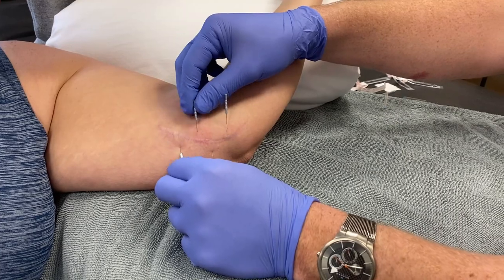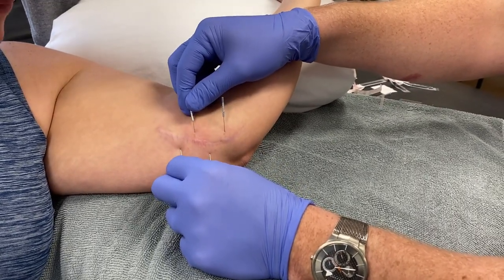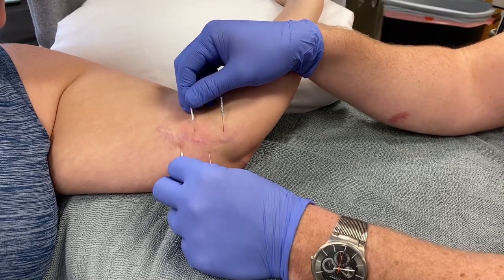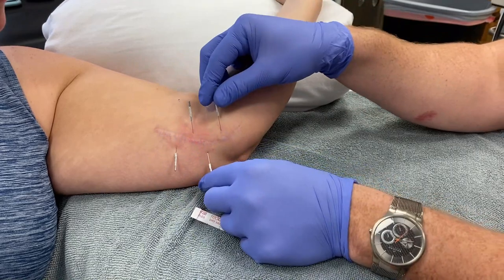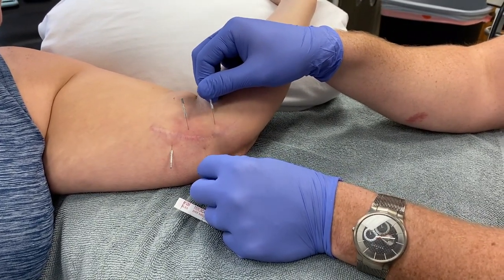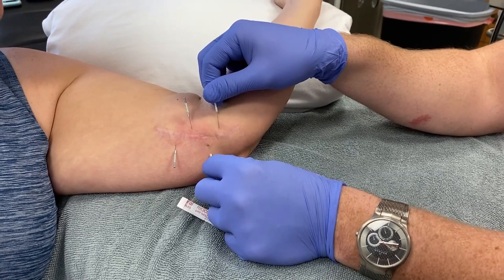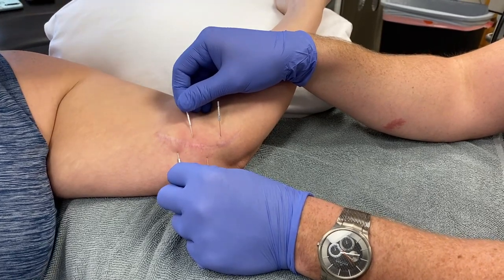Just spin that needle a little bit to wind the collagen. You can see a little bit of color change right where I swiped my finger, and you can see how the wound collagen is moving the scar — which is pretty cool. It goes without saying: always follow CDC standards of disease control and prevention, always use gloves and alcohol wipe down before inserting needles.